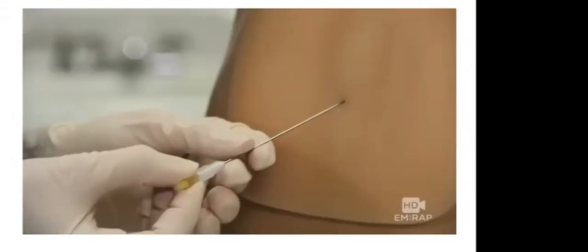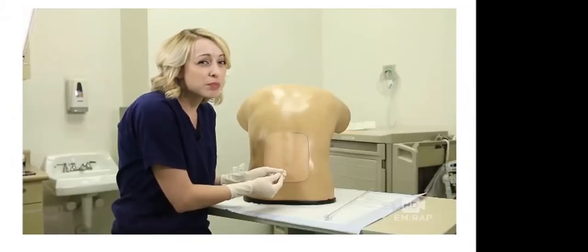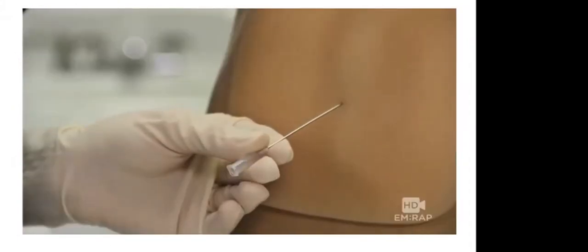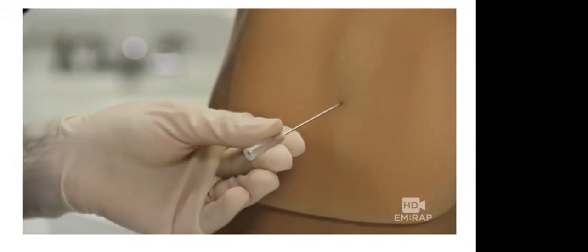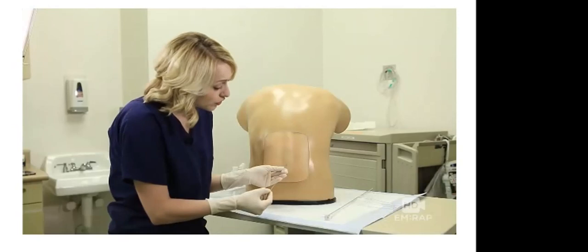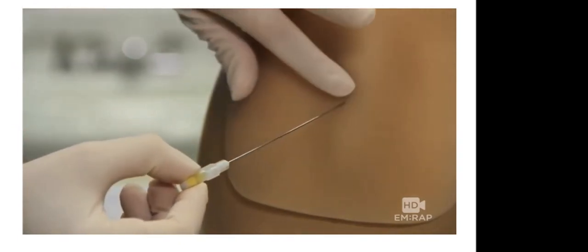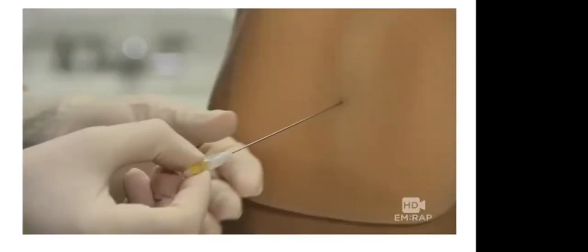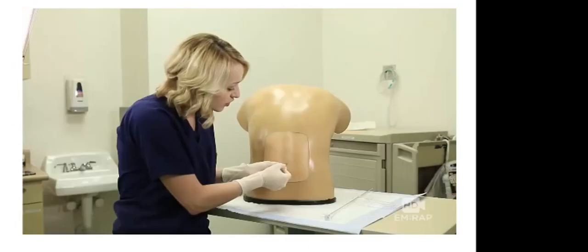Now, it's important as you advance the needle that you're checking frequently if you're in the spinal fluid, because you won't always feel that pop through the ligaments. So remove the stylet and check for spinal fluid, and then advance it a little further. And then remove the stylet and check for spinal fluid, and then advance it a little further. Remove the stylet. Now, if you're still not getting spinal fluid after a few tries, you can remove the needle, or you can pull it out just to the subcutaneous tissue, repalpate for your landmarks, and insert the needle again when you change angles just a little bit. Insert.